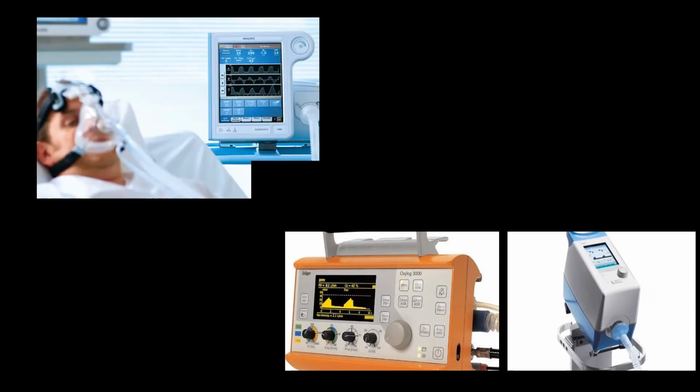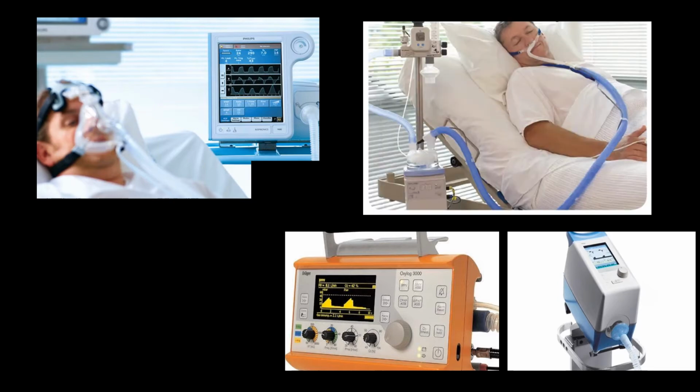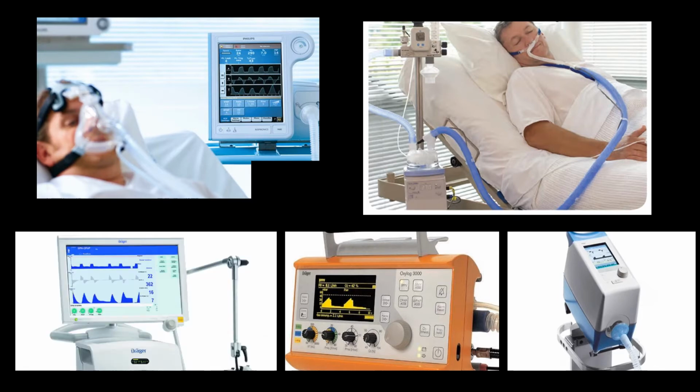Here are some of the ventilators that we use at Frimley Park Hospital. Oxylog 3000, this is primarily used for patient transfer. We also have Draeger Carina, which you can use for invasive and non-invasive ventilation, and they're quite portable. We have dedicated non-invasive ventilators. This is the Philips V60 that we use. We also use a high flow nasal oxygen system, but primarily we use this system through our main Draeger ventilator, which is the C500.